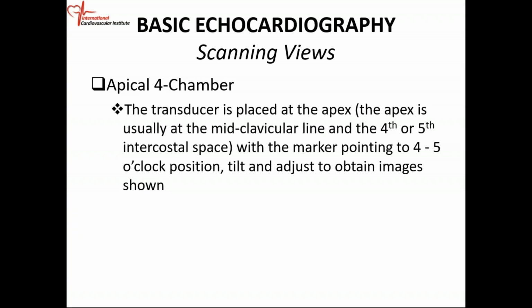If you didn't have the gel there and you were just talking about air, it would be traveling slowly. Remember, the speed of sound in air is 331 meters per second, whereas in soft tissue it is 1540 meters per second, much faster. So the function of the gel is multifactorial.